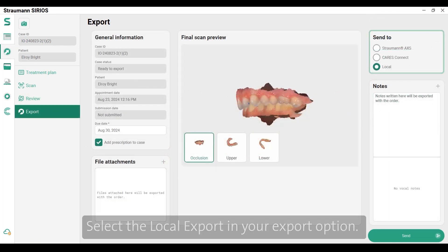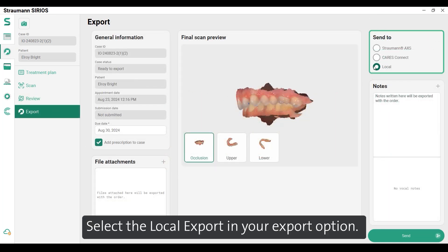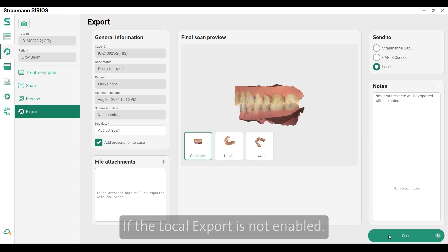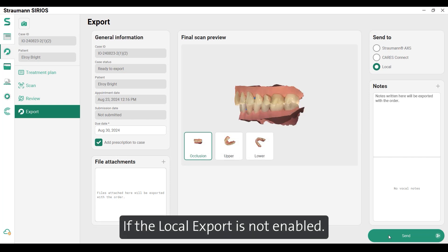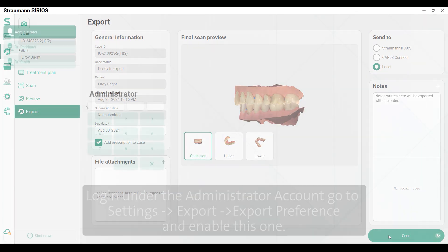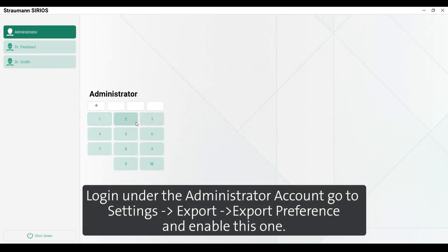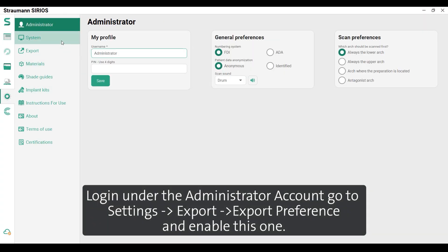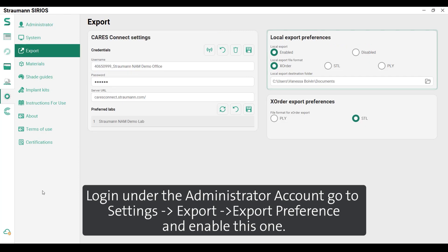Select the Local Export in your Export option. If the Local Export is not enabled, log in under the Administrator account, go to Settings, then Export, then Export Preference, and enable this option.